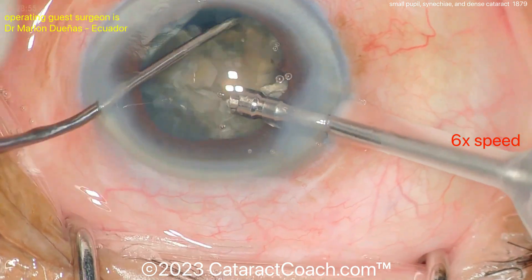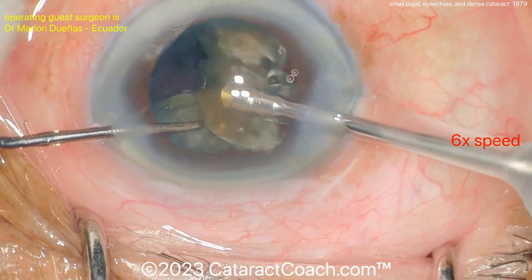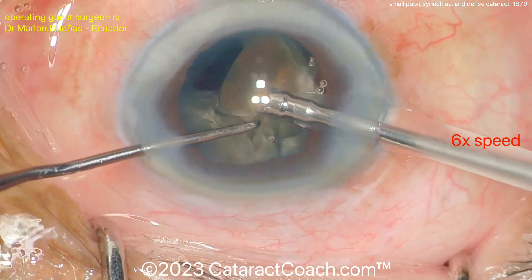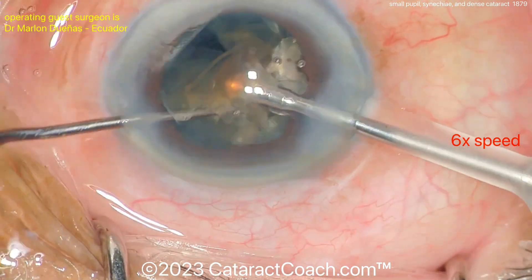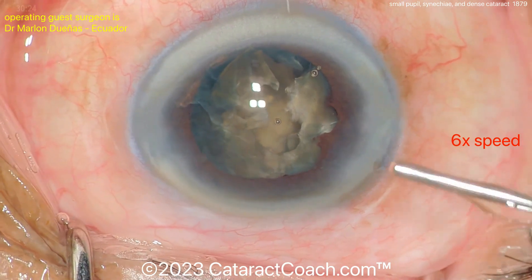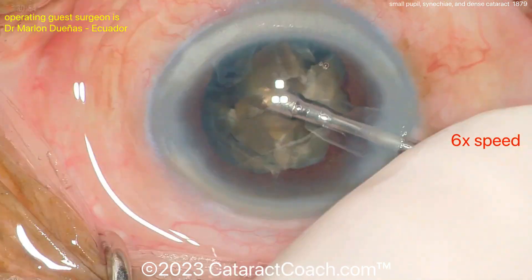As we use BSS fluid to emulsify the cataract and bring pieces to the phaco tip, that fluidic flow can wash out the dispersive viscoelastic that was protecting the endothelium. Going back inside to recoat is therefore very helpful to further protect the cornea. Another recoat — good move, very nicely done.